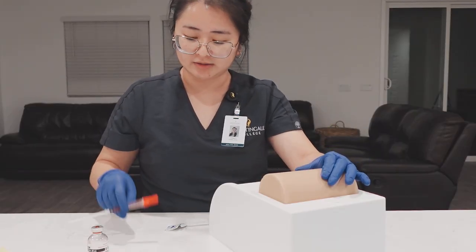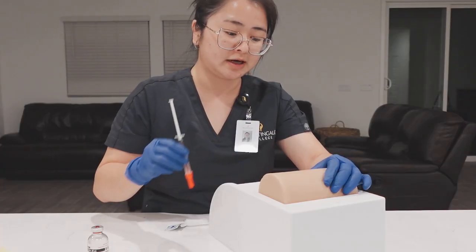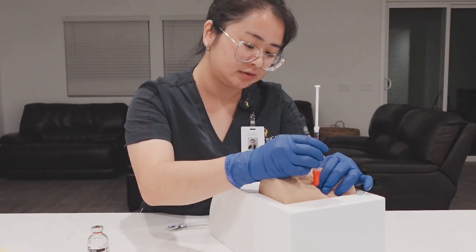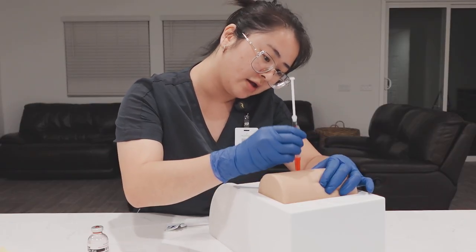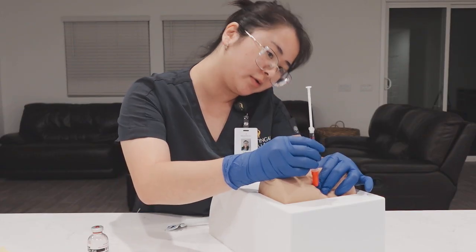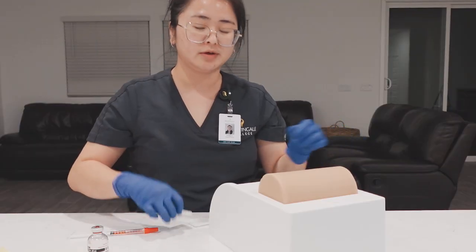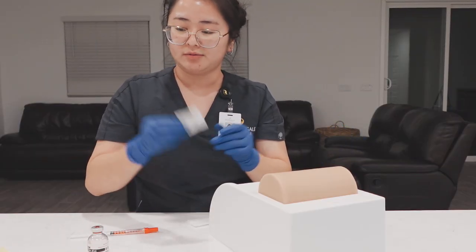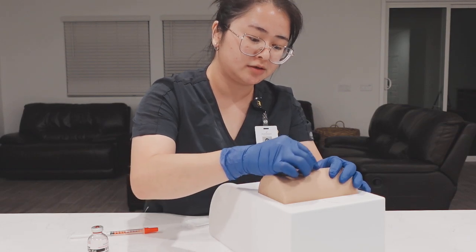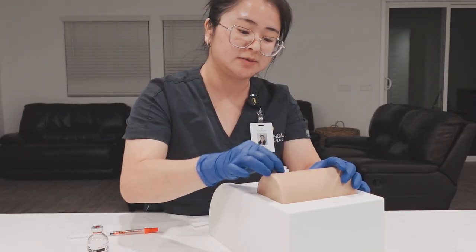Okay, before we actually administer the injection, we're going to pinch the area, and we're going to measure with the needle to make sure that it is 1/2 of the needle from top to bottom, and it seems to be appropriate. You can see from both sides. So now we're going to put this down. We're going to use an alcohol prep pad. We're going to dispose of this in the trash, and we're going to clean the middle, from the center to the outside. It's supposed to be 2 inches.